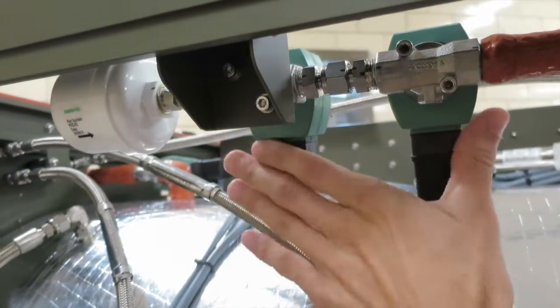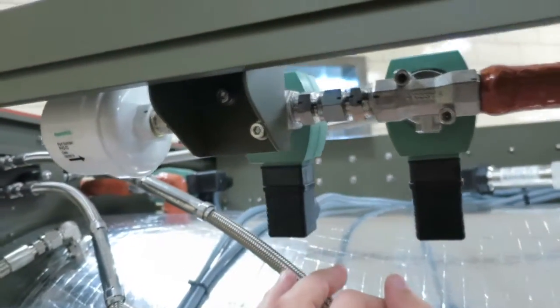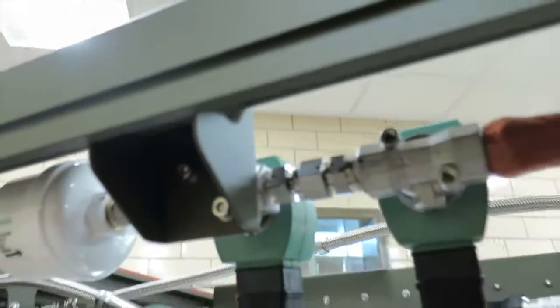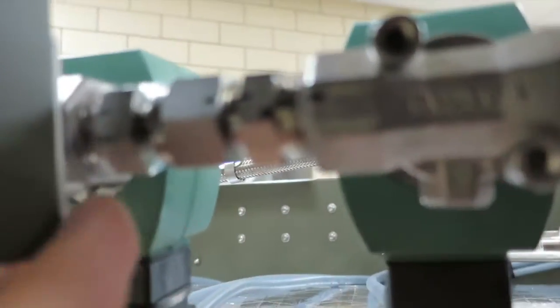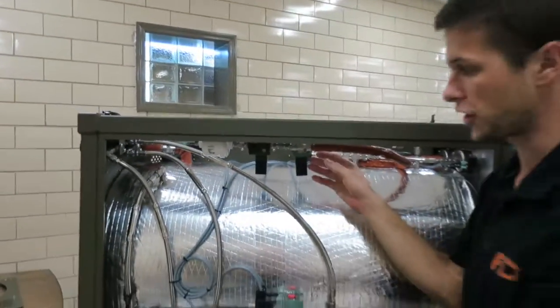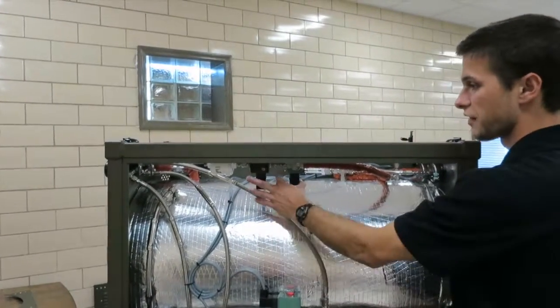So again, these are the vacuum brake valves, and it's very important which direction they go. There's a flow arrow on them, and the arrows should be facing each other. There's also a 1 and a 2. On this valve there's a 1 and 2, and on this valve there's 1 and 2. Whenever you do maintenance on these, make sure you install them with the flow arrows facing each other. So, the vacuum brake valves.